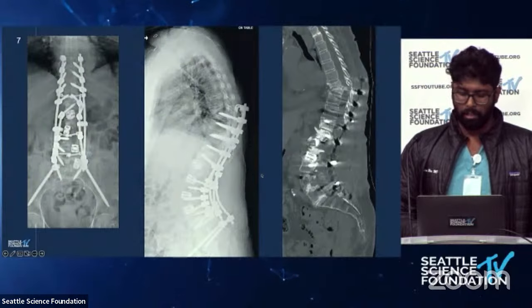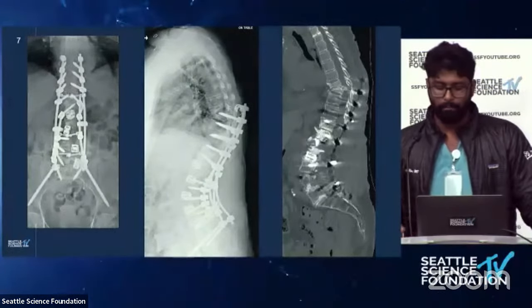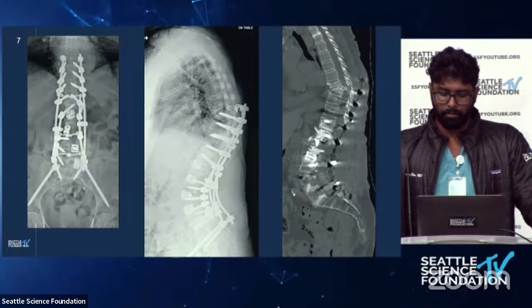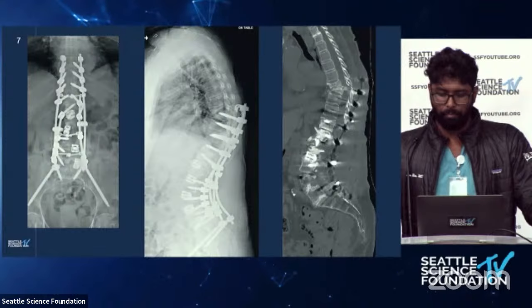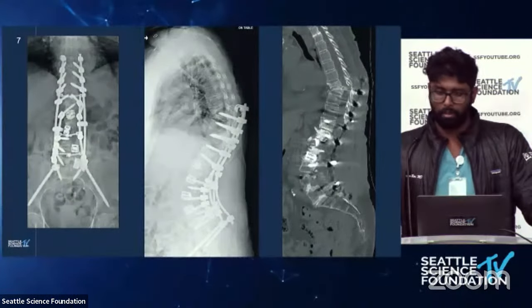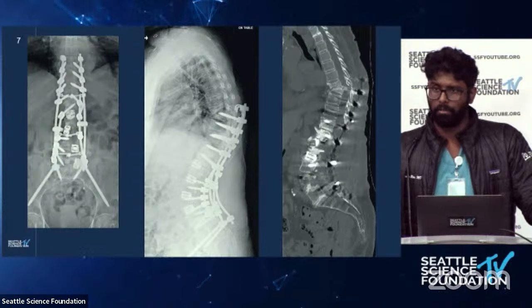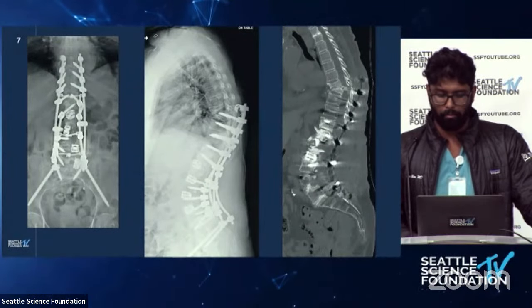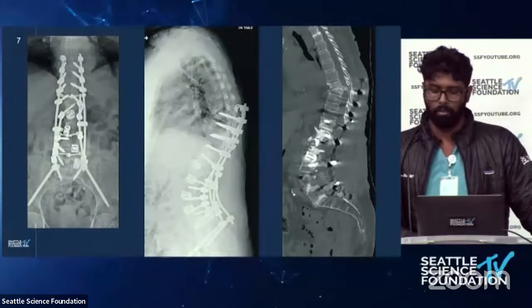And then, like you're saying, it is odd that they had that fracture there. Her bone stock looked pretty good, so it's probably just from the trauma. But definitely doing a two-level corpectomy is what we would have done. And maybe we would have gone to T4, T3, maybe not all the way up to T2, but otherwise that's what we would do. We may have cement augmented as well, just to have a stronger space for the corpectomy cage to sit, the two vertebral bodies above and below. But other than that, I think what we did here was on par with what we would have done in Tampa.